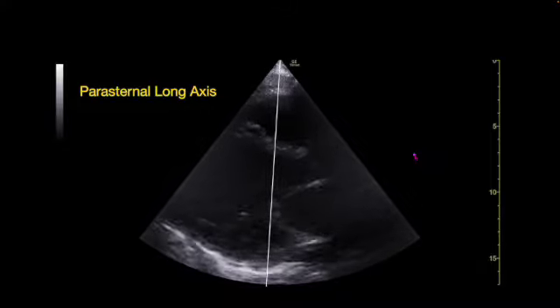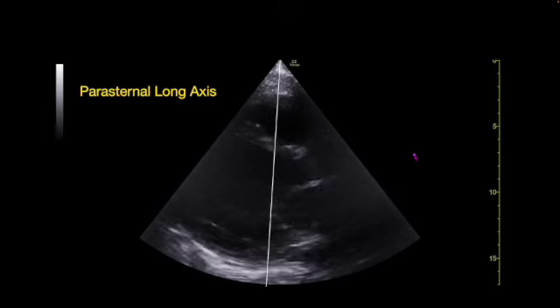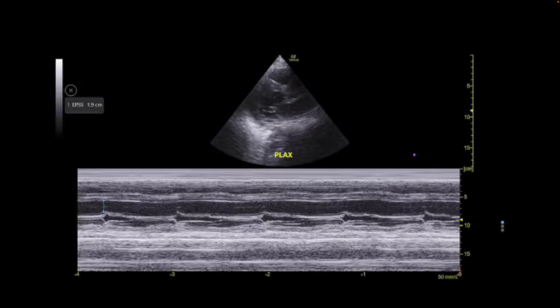I would say when you're first starting out, practice your EPSS. Throw the M spike over it, hit it again, and you get this nice waveform, which is distance over time. It is basically plotting all the structures that this M spike transects.